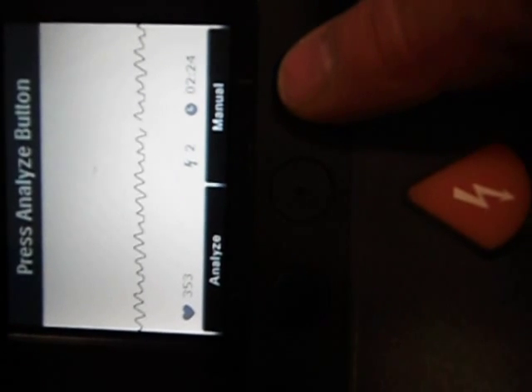So, our two choices again would be manual, so that we can make a decision on what we see, or analyze to let the unit examine again the VF wave. This time, we'll push manual.